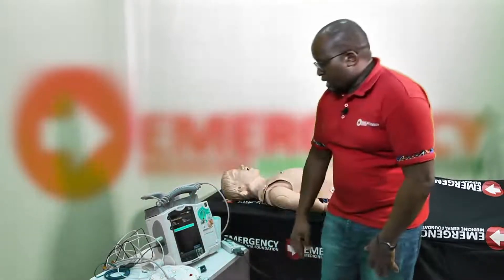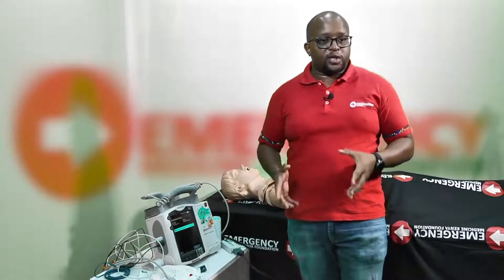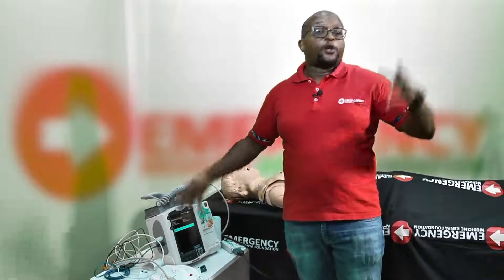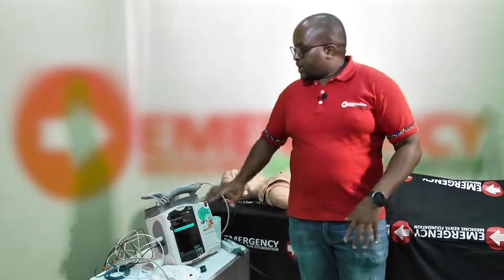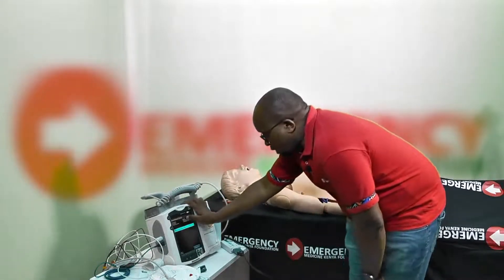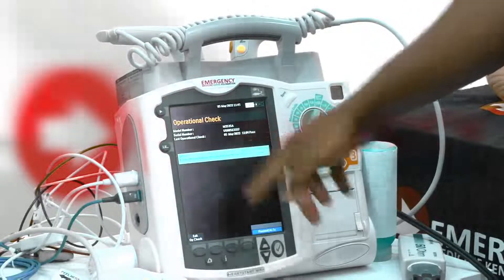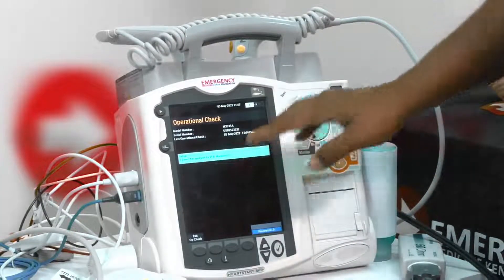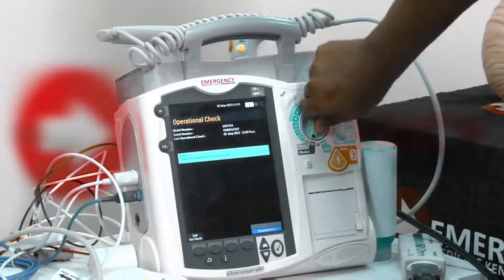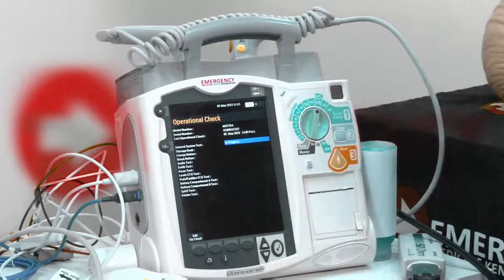In operational check mode, you just follow the instructions on the screen — you don't need to memorize anything. The screen shows the model number, serial number, and the last time the machine was checked. It then prompts: set the therapy knob to 150 joules. I turn it to 150 joules and the machine automatically begins going through a series of tests.